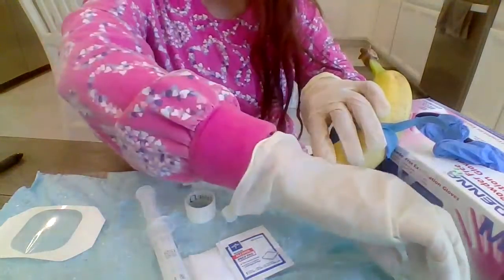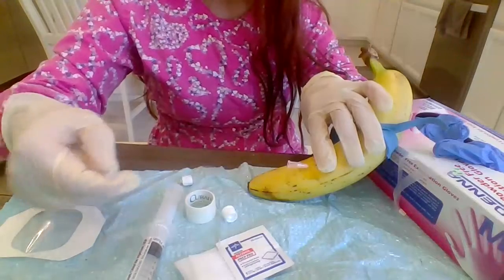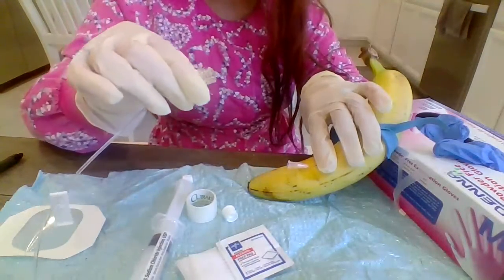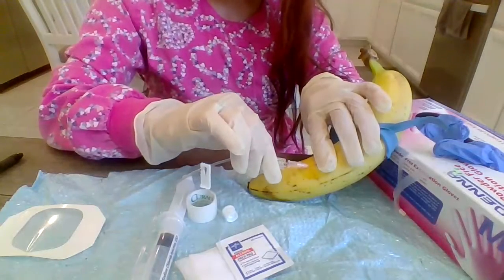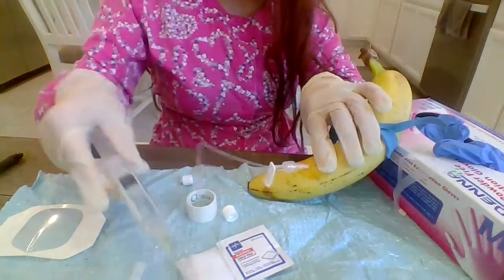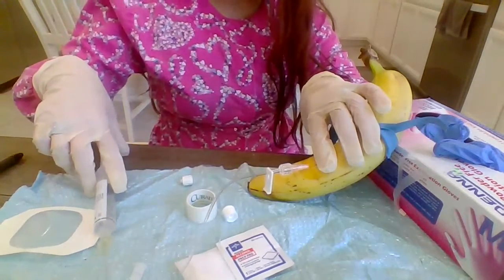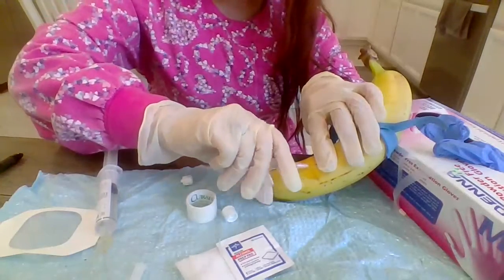Now I'm going to connect the IV extension catheter without touching the connector. So just going to go ahead and flush it so I can see that the saline went in. So I will go ahead and lock it.